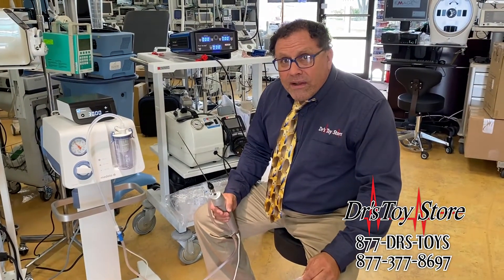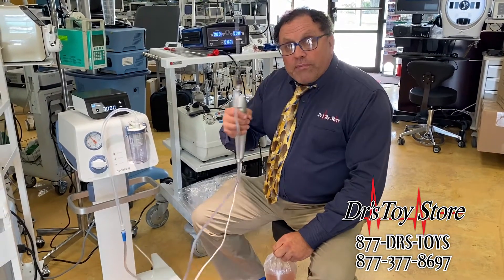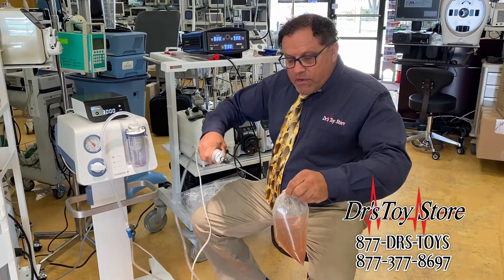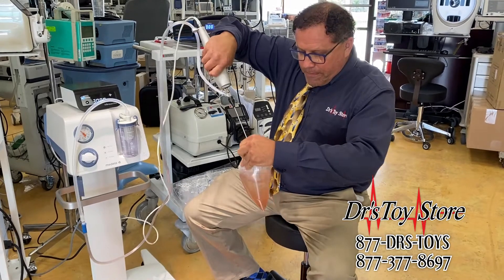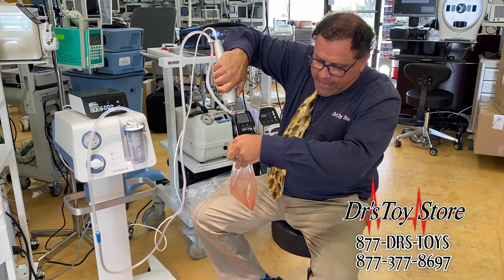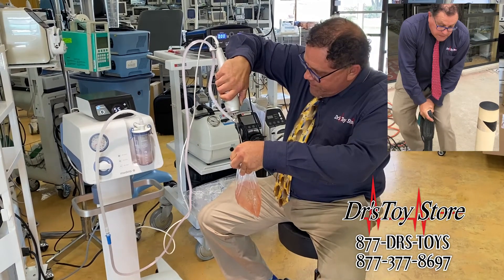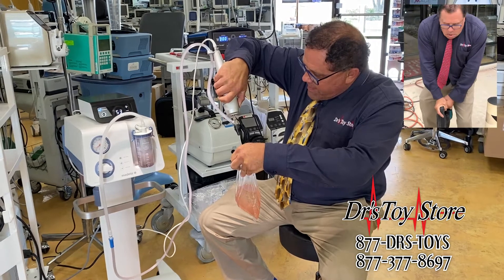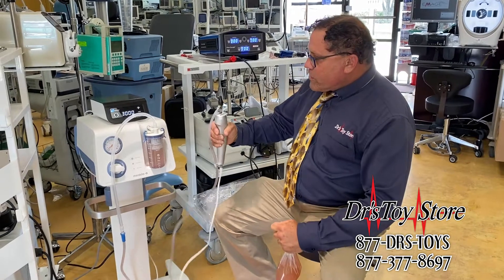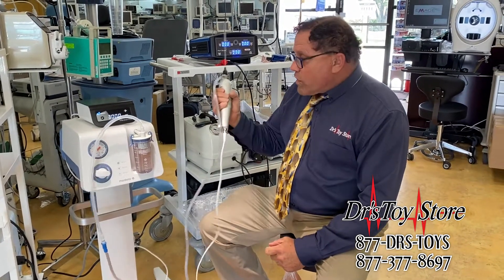Okay, everybody ready? Here we are. Got brine shrimp. I've got the Medela and two three-millimeter equivalent cannulas. What I'm gonna do right now is go right in the brine shrimp — there we go — and turn this on. We're filling up right now. Okay, we just filled up and we're done with that.